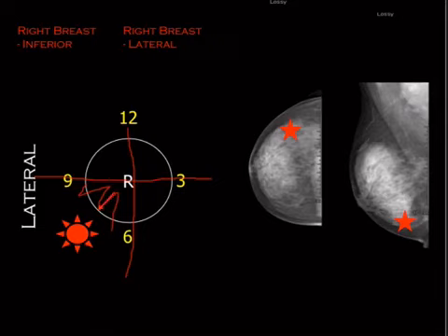And if you were going to go in and ultrasound the patient, which you would, if this was a diagnostic callback, and we'll talk about this more. If this was a screener that just came through on the pile, in the United States there's an age recommendation where women start getting mammograms every single year, all the way up until they're dead, basically. If you make a finding, it'll be called back into the diagnostic pile. Then if you confirm the finding is real, they'll almost always get an ultrasound with a few exceptions.